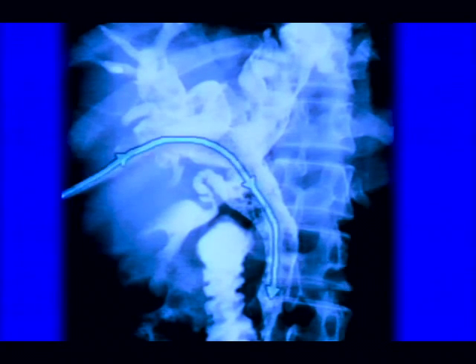In this patient, we can try basket stone removal from right intrahepatic duct, and then left intrahepatic duct, and finally common bile duct. However, this approach would take a lot of time, and the number of cholangioscopic sessions would be increased. My advice is firstly to proceed to the distal common bile duct and ampulla as early as possible using lithotripsy and irrigation method. Secondly, dilate distal common bile duct and ampulla using 8 to 10 mm balloon, and then keep an 18 French PTCS catheter into the duodenum for 2 or 3 days.